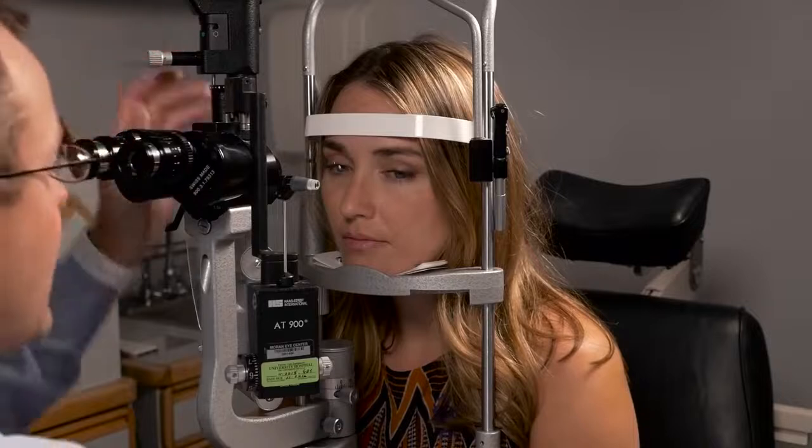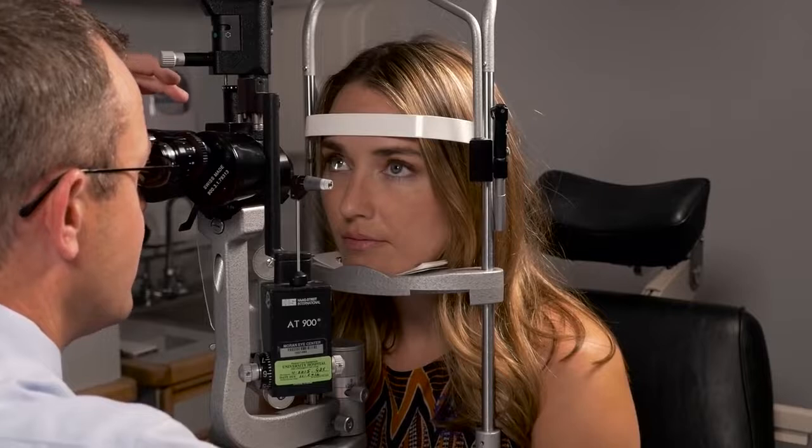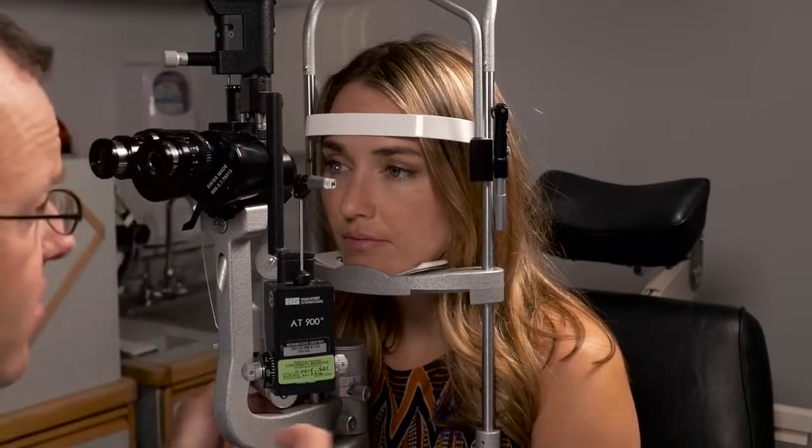And so how you look for a Shafer sign is you focus in on the lens, narrow the beam, and make sure it's nice and bright, and then you tell the patient to look up, look down, and look straight ahead. And then as they're doing that, you move the joystick backward and forward until you can see the little collagen fibers. And intertwined or floating around those collagen fibers could be those pigment cells or the tobacco dust cells from a retinal tear, or inflammation or blood or something like that. And so after seeing that, then you're going to go to the posterior segment exam of the eye.